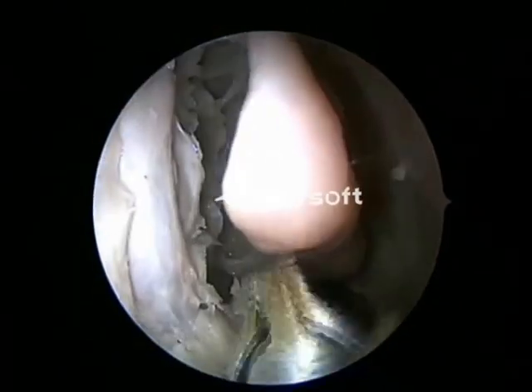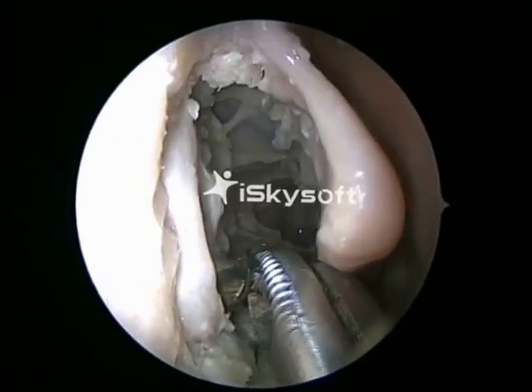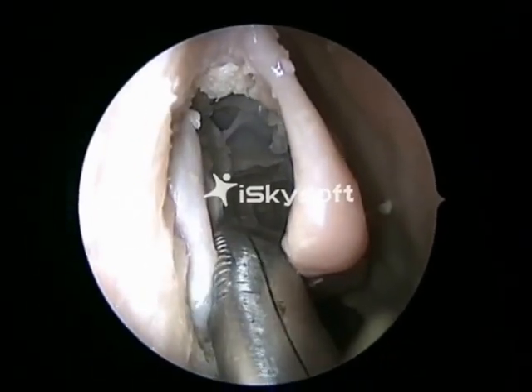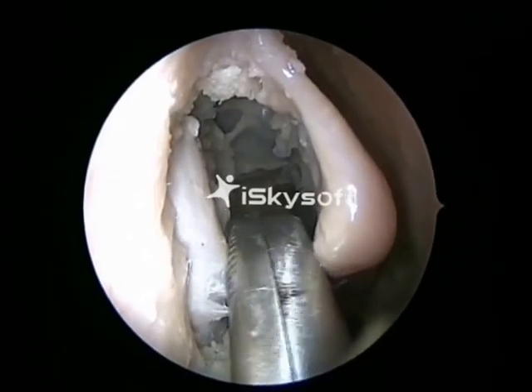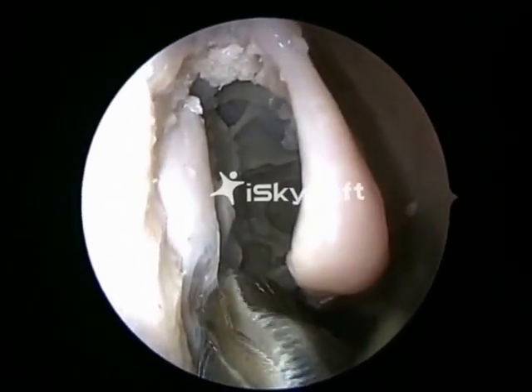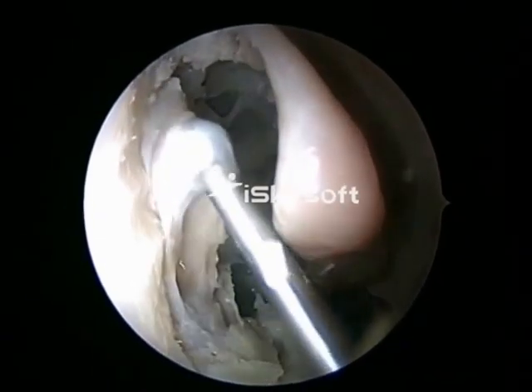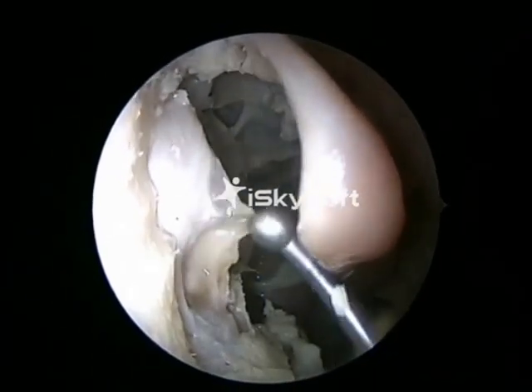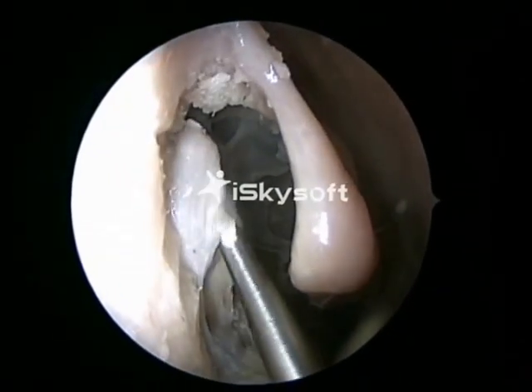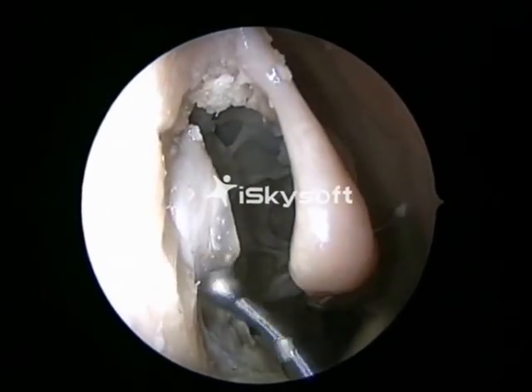That's a vertical incision being given. And then we use a backbiting forceps and we punch the inferior portion of the lacrimal sac. We then use a ball probe to enter into the sac. You can see the ball probe entering the sac very nicely.